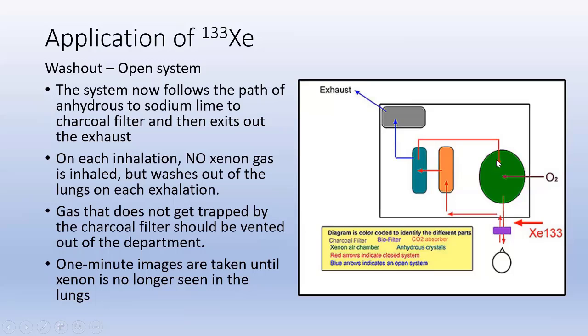When they inhale what's in here, again, oxygen is coming in. And the idea is that they're slowly washing out that xenon, so the xenon is no longer circulating through the body. In that process, again, we refer to this as washout. Washout should probably last 3 to 4 minutes if the patient does not have COPD, as I indicated earlier.